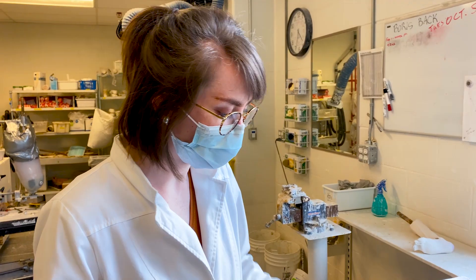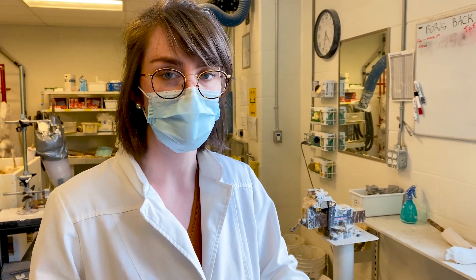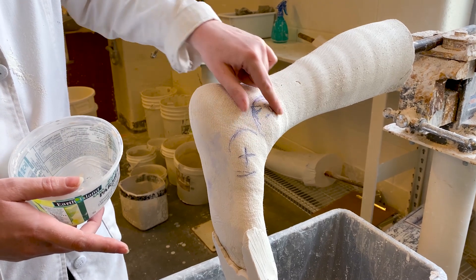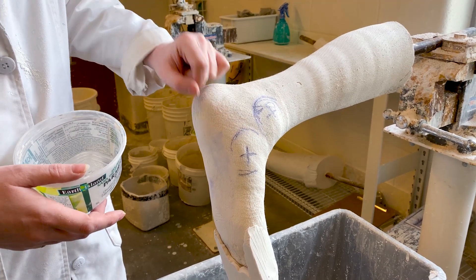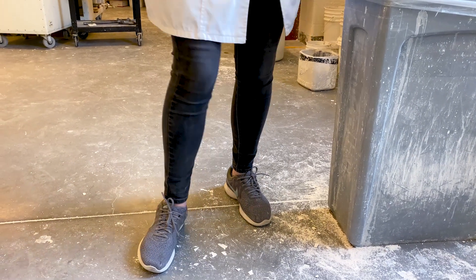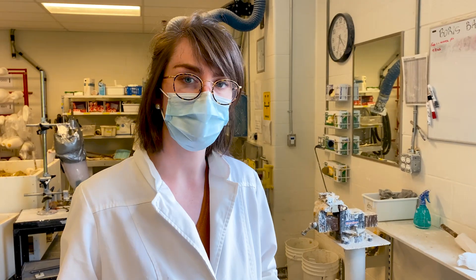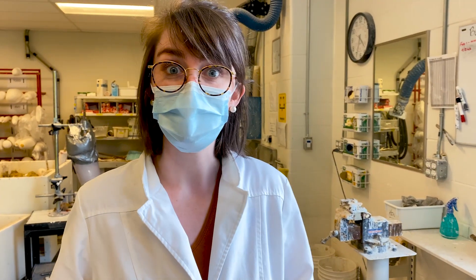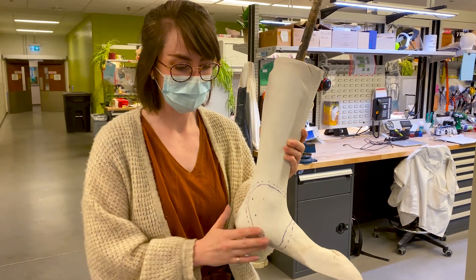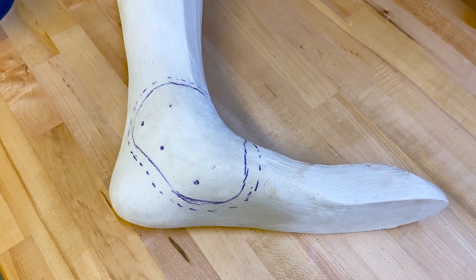Then Wendy will modify the cast based on her clinical assessment. You can see some areas of really bony prominences — those are spots I marked with the indelible pencil where she might need extra space. She walks on the medial border of her foot, there's a lot of pressure and callus there. We want to keep her up and out of that position so that callus can dissipate. Here's the finished model, which clearly outlines where the patient needs extra support and a built-in strap to pull her foot into a more normal position.